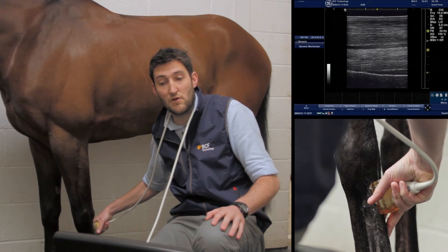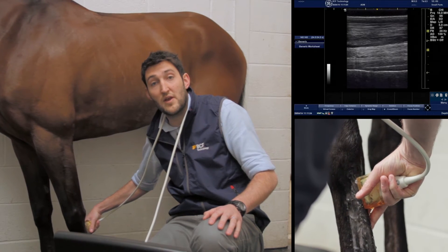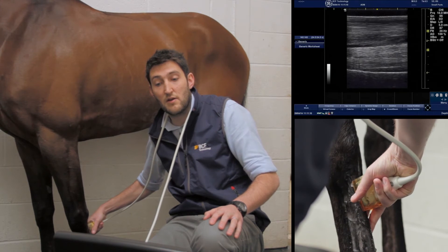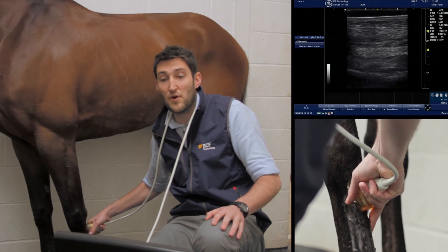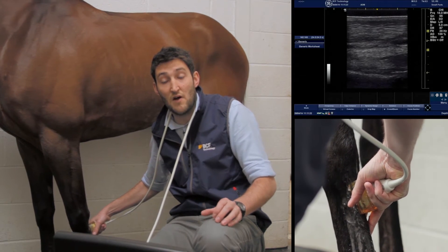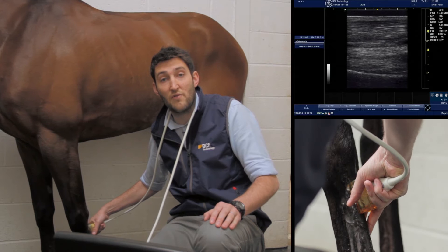What you do want to take care to do is, once you've done that, just slide the probe across the leg to the medial side just to check the edge of those fibres, and we'll also then slide it to the lateral side. The reason we're doing that is because sometimes if you have a hole in the tendon — a core lesion — you might find it only occupies a percentage of the width of the tendon, and it's easy to potentially miss those if you're just looking at one thickness.